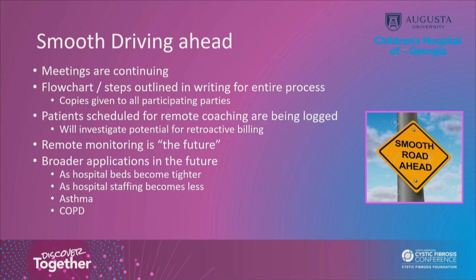Remote coaching session would be scheduled, and then once that was completed, the PFT lab staff would actually chart. We found a place in the medical record where they could chart home spirometry coaching completed. A message would be sent in the portal to let the providers know, and then they could know to look in the dashboard and print it out. In addition, the PFT lab would print out the report, and we have a dedicated spot where they could put the report in our workroom so that the providers could interpret it and send it to medical records.